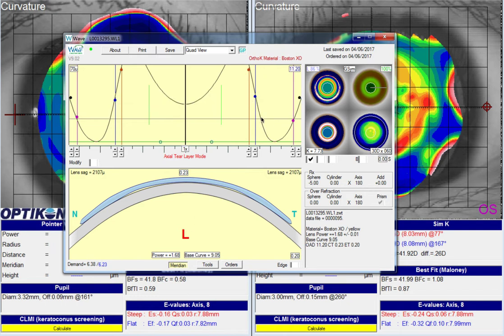So on this new lens, we have an alignment zone that's fairly parallel to the previous lens. It's just a little bit taller. It's going to hit the cornea a little bit sooner. It looks like there's a ton of central clearance, but I think if you put the lens on the eye and check the fluorescein, you're not going to see this much clearance. You may get a little bit of wisping underneath the base curve, but that's okay. We don't want there to be too much compression on the center of the cornea either.